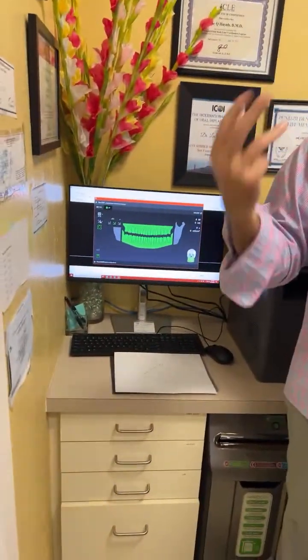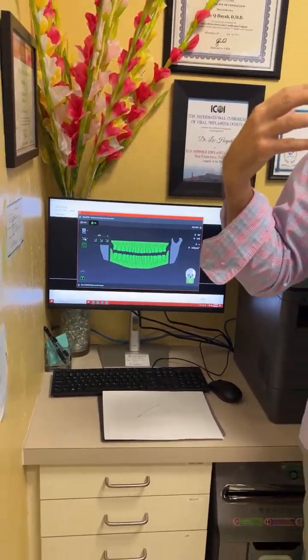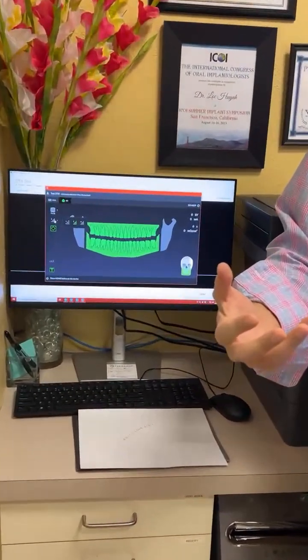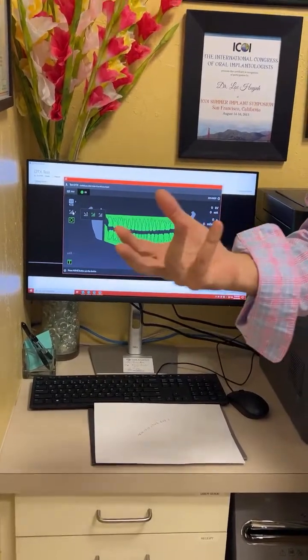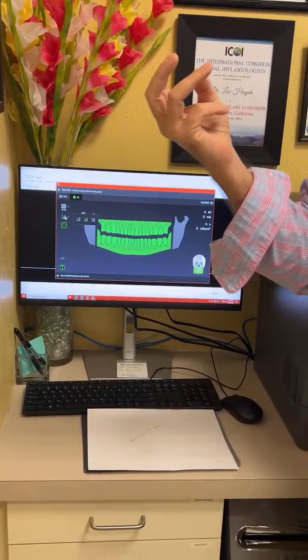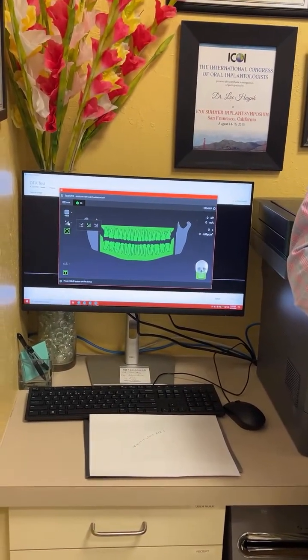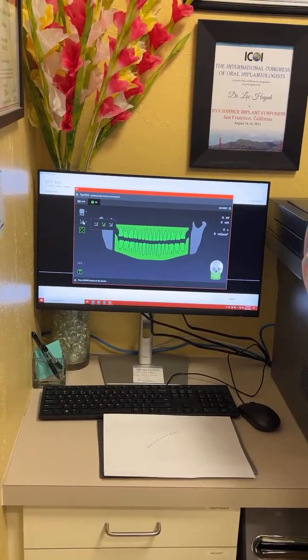Grainy. Well, like I said, you don't need high res to see what I just described to you. That is perfect for that. If you're doing condyle assessment and you're looking at the joints, you don't need high res. Low dose is fine for that. All you need to do is see the bone. You're not going to see disc space anyways because radiation doesn't do a very good job with soft tissue. Okay, that's where MRIs and other things could come into play.